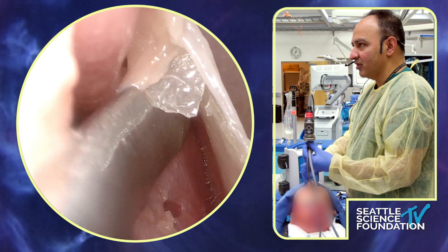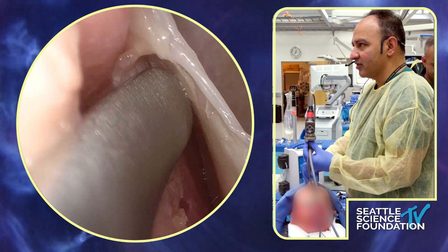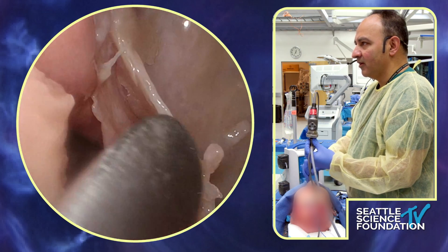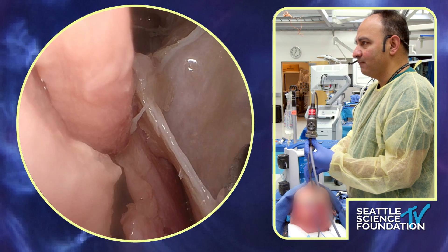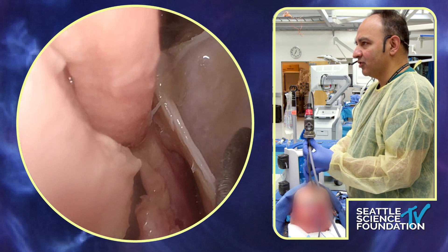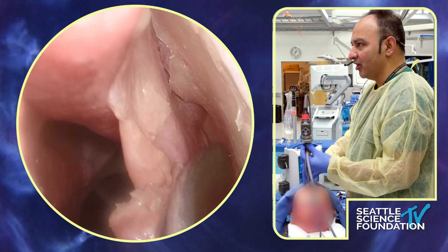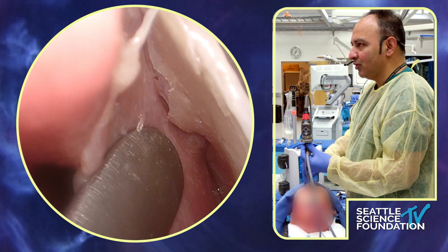And there — up here — there is a little crista right here. I hope you guys can see that. Let me open that up a bit more and get rid of some of this soft tissue. Now let's look back at the sinus — the superior medial aspect of the maxillary sinus is a good landmark for the sphenopalatine artery. Look, that crista is here. Let's see if we find the artery behind it — and sure enough, there it is, just very reliably. Here's that little prominent bone.